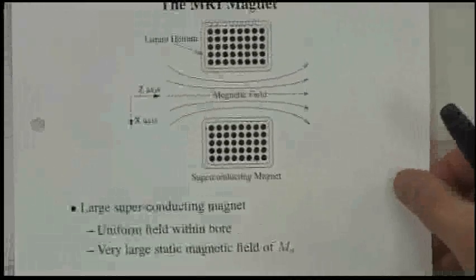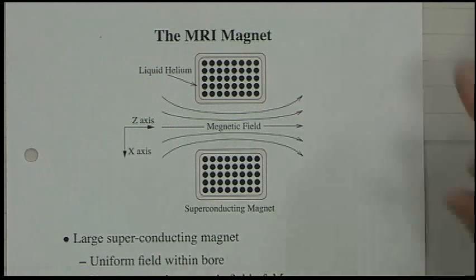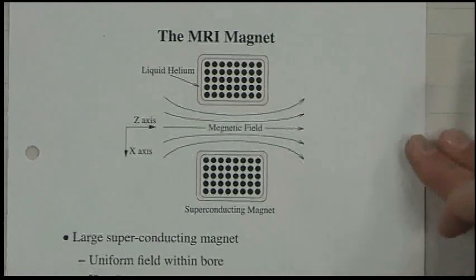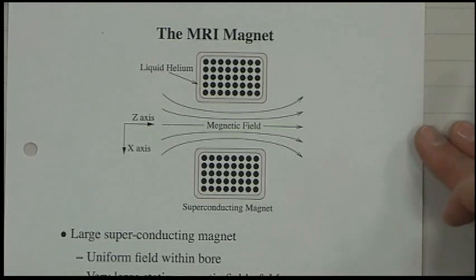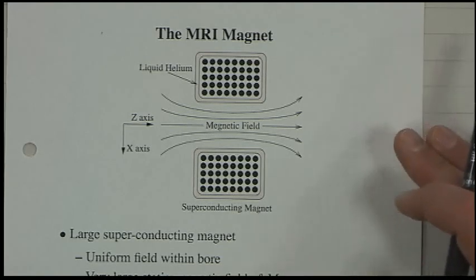Now, what ends up happening is actually quite interesting: traditional MR scanners use very high field strengths. There's talk about low field strength MRIs that would use superconducting detectors, but that's not really practical.